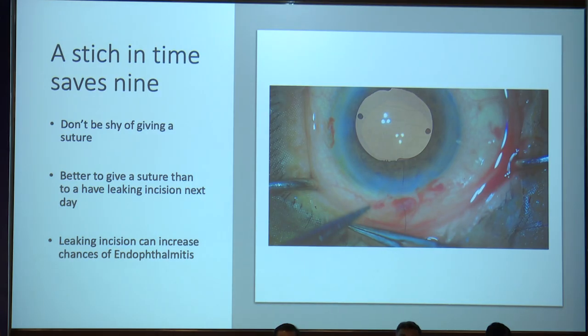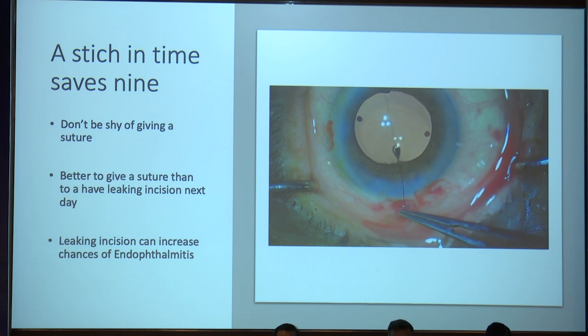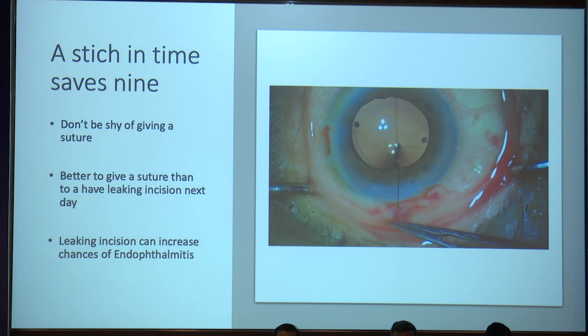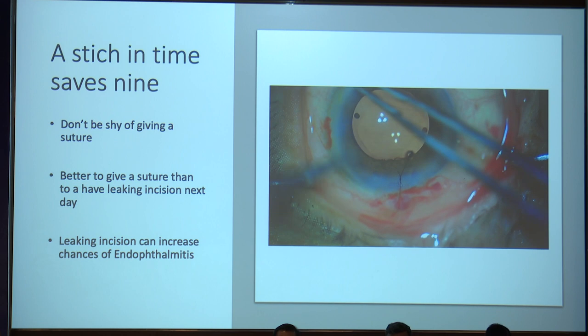Don't be shy of giving a suture. In case you are having a leaky wound and you're not able to seal it in any way, go ahead and give a suture, because it is better to give a suture than to have a leaking incision the next day and a shallow chamber or iris prolapse the next day. So don't be shy of giving a suture.